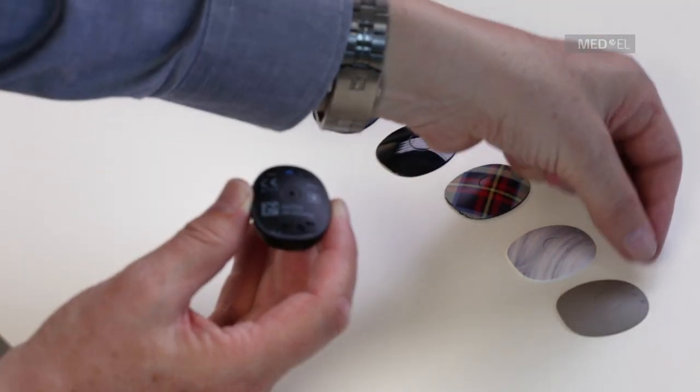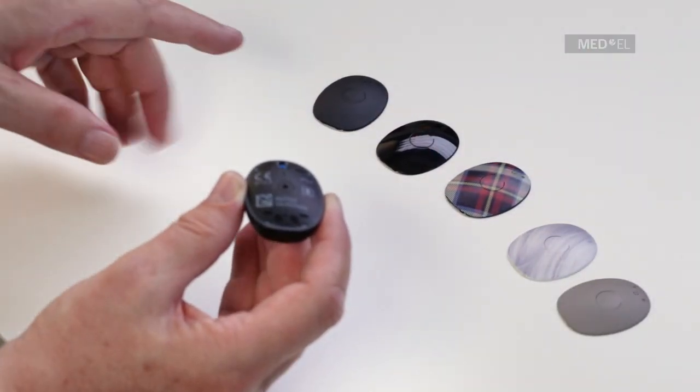Check out the whole range of design covers at medel.com/RONDO2.